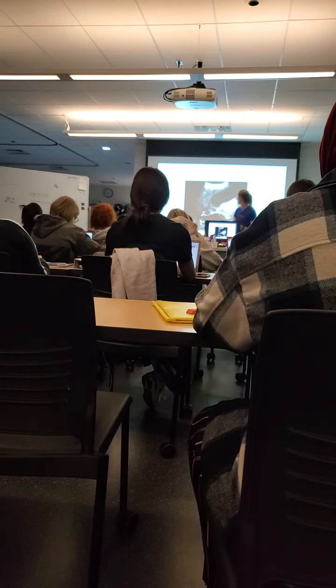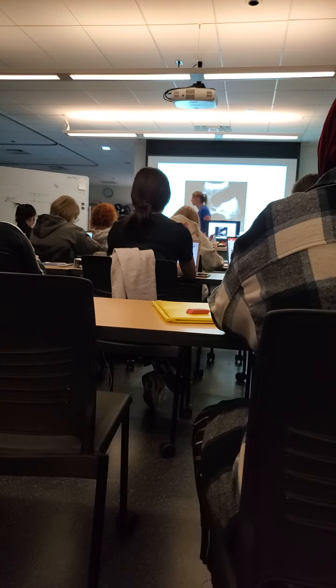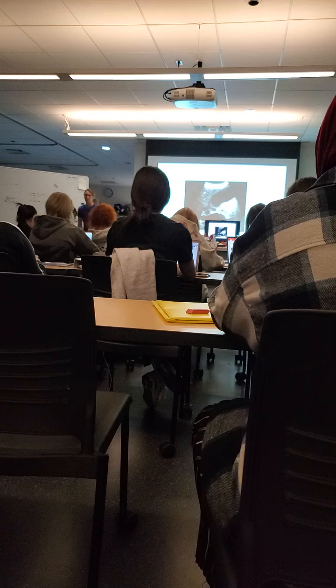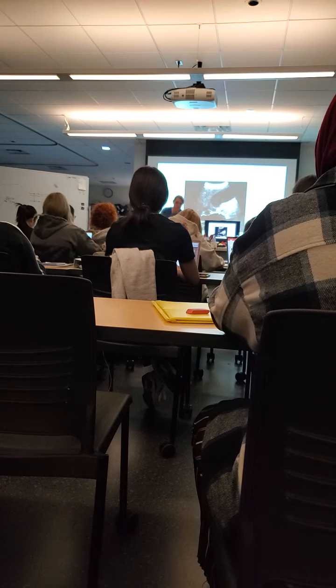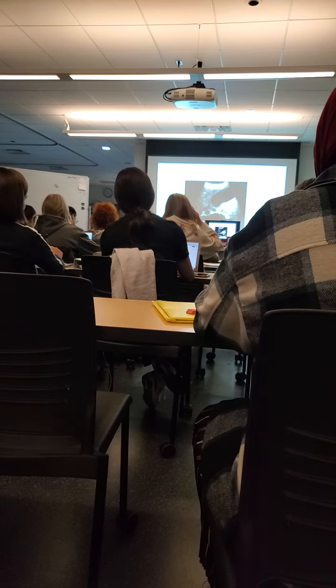So I'll give you some measurements on things here. So I'm a 55-year-old female, right upper quadrant pain.